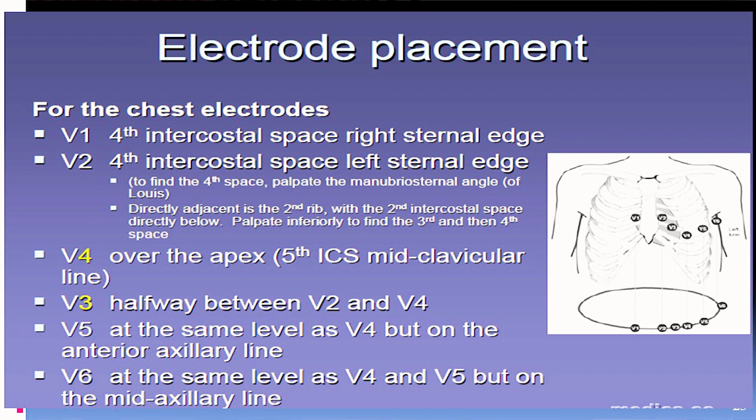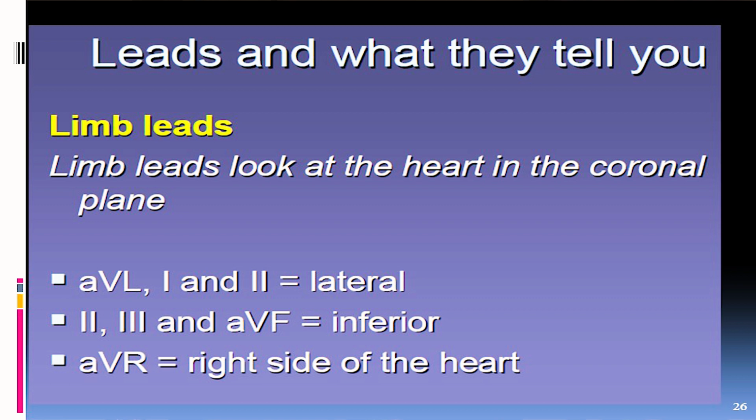Even if you don't understand now, when we come for the demo, at that time you can ask and then we'll tell you. This slide shows where each electrode is put. Then we have to see which lead reflects which area.